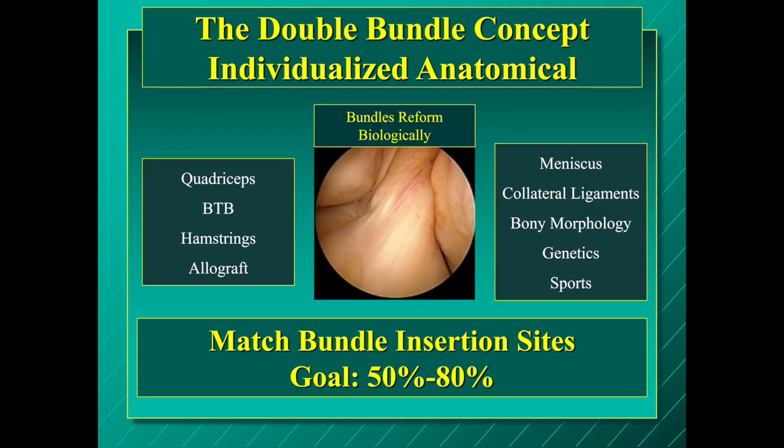The double bundle concept applies this definition to allow for individualized anatomic reconstruction. The two bundles are a biologic phenomenon and will reform when ACL reconstruction is done properly. Again, the goal is to restore 50 to 80% of the tibial bundle insertion sites. This means selecting between quadriceps, BTB, hamstrings, and allografts, as well as paying attention to the meniscus, collateral ligaments, bony morphology, genetics, and return to sports.